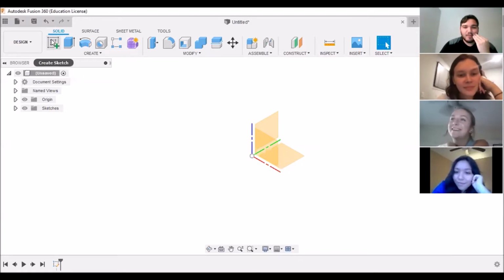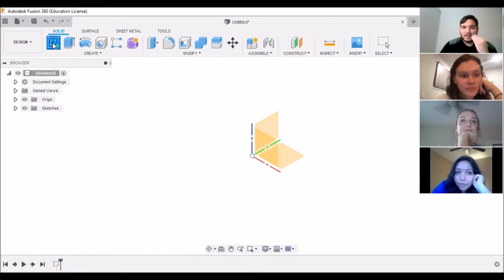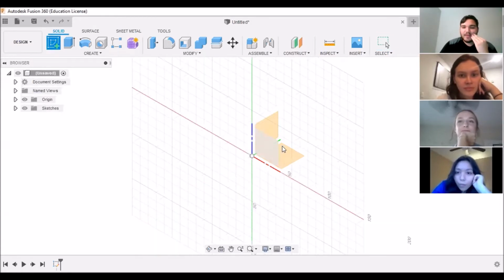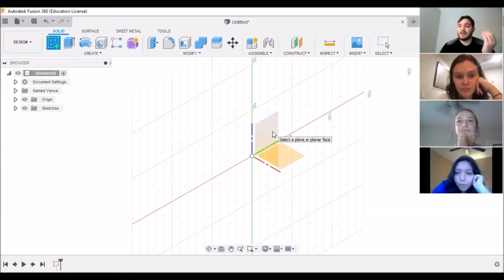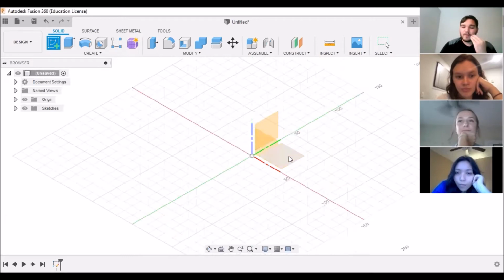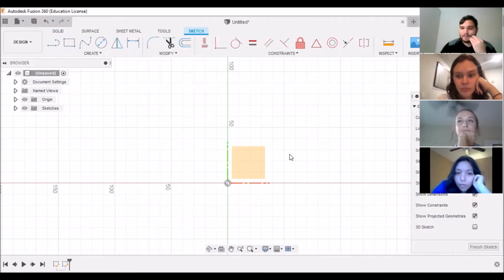So we have up at the top left, we have create sketch. So if we click on that, we can then pick any of our 3 planes that are in the middle. So if we want to build, let's just say a fingertip, we can start on the bottommost plane and create our cylinder from there. So if you don't mind clicking that.